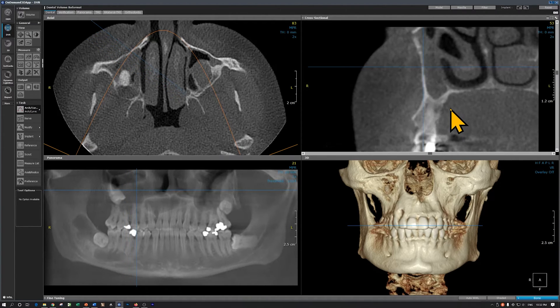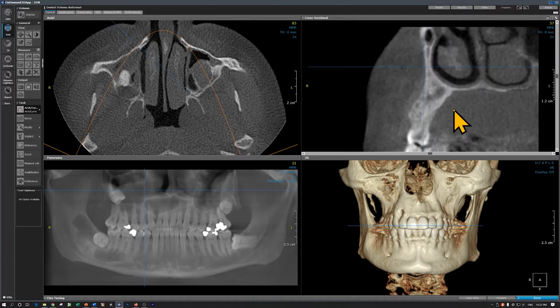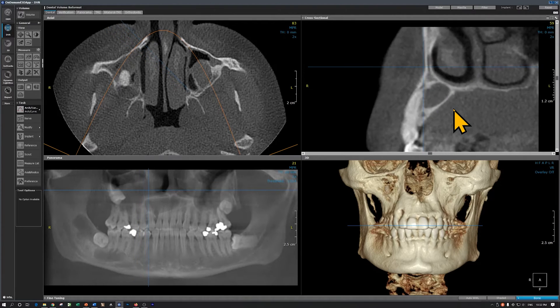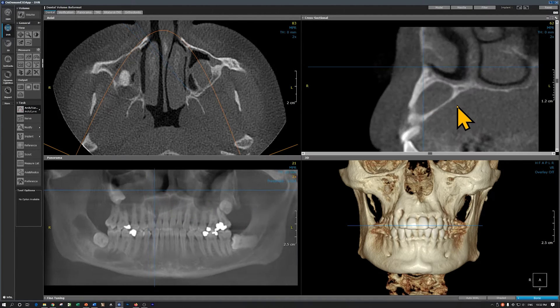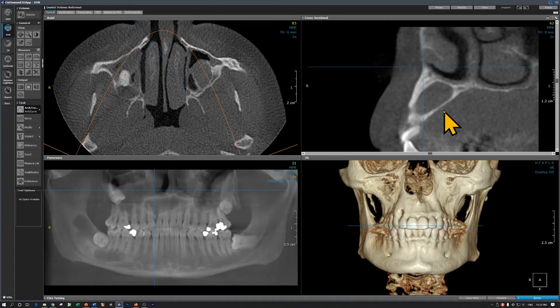Coming mesially, I'm almost in the area of the canine and here is the other odontogenic keratocyst. You can see that this is more elongated but not expanding the buccal or the palatal cortical plates. This is one reason that an odontogenic keratocyst can become fairly large before it's detected clinically.